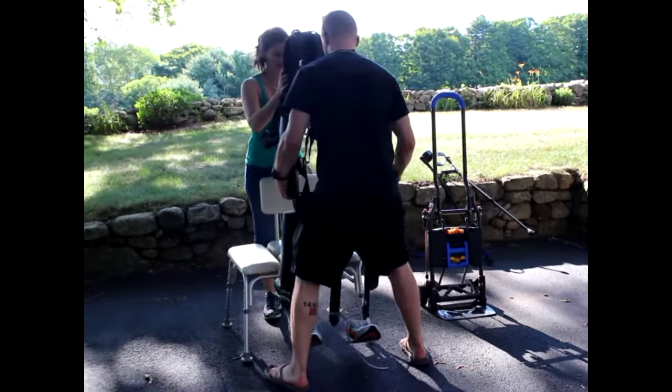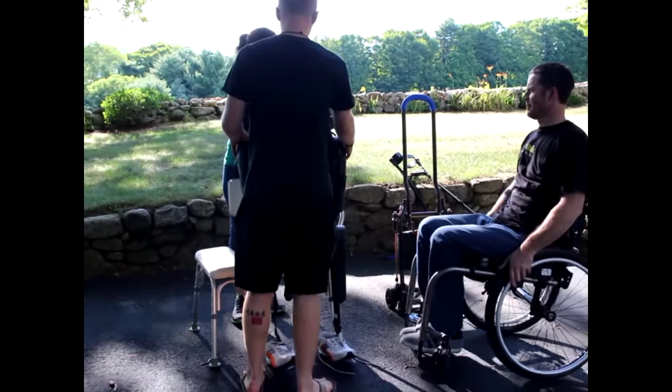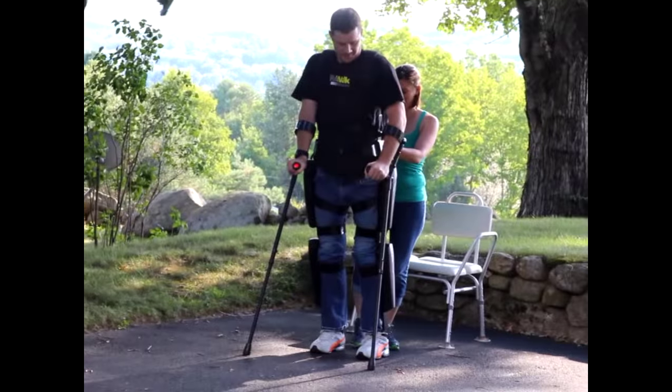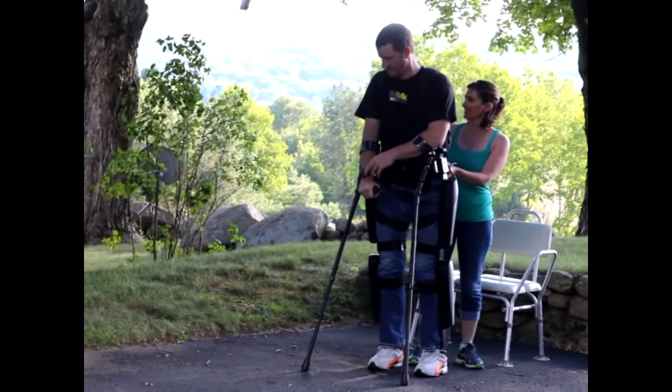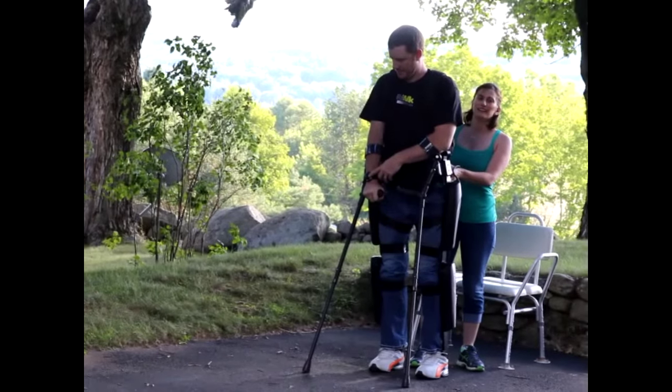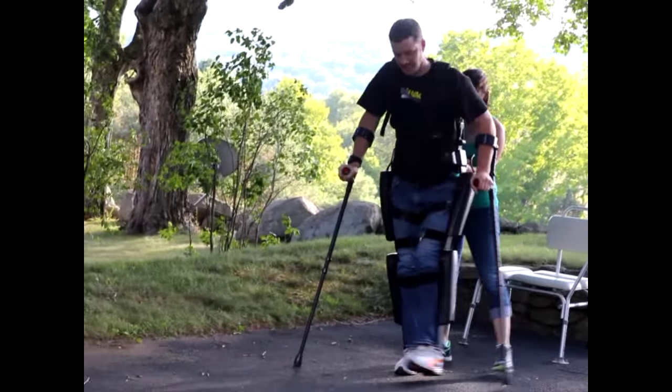Having the ReWalk at my home and at my disposal, anytime I want to get up and leave my house, I can. I can transport it in my car and I can go down to downtown Keene and walk around. I can go to the middle school track, I can walk around.